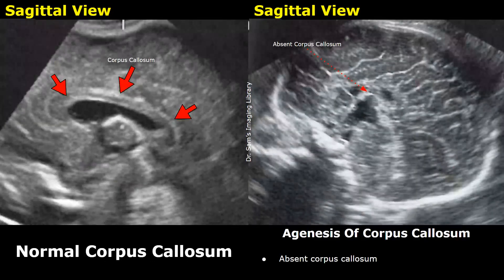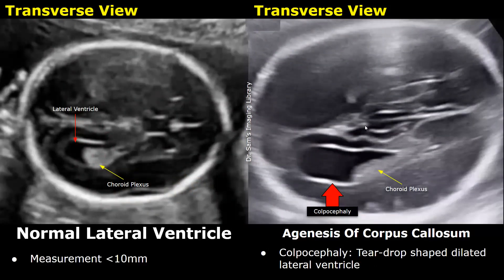This is an image of a normal corpus callosum in sagittal view. The corpus callosum connects the right and left hemispheres of the brain. In agenesis of corpus callosum, the corpus callosum is absent, which can lead to a dilated third ventricle and gives an abnormal appearance. The normal measurement of the lateral ventricle is less than 10 millimeters. A teardrop shaped dilated lateral ventricle — known as colpocephaly — is also a feature of agenesis of corpus callosum.